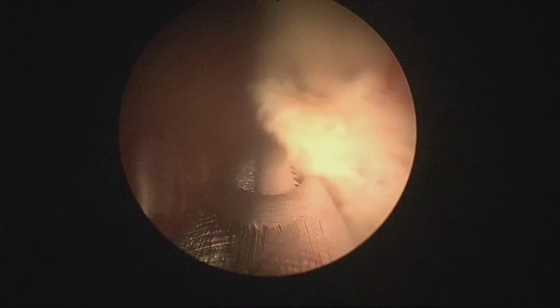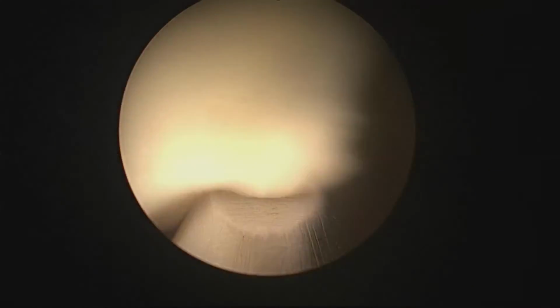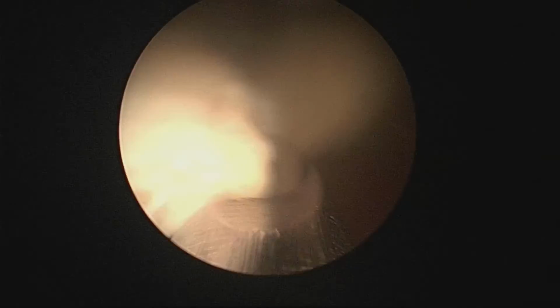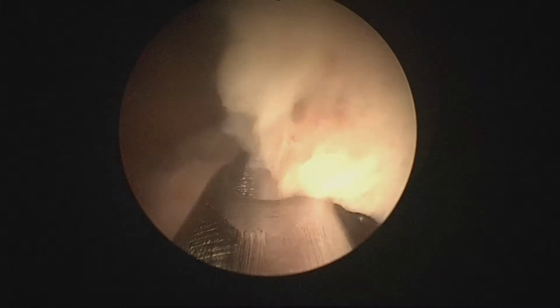So these operations are not lengthy anymore, mainly because of the morcellation. But I have to say that after using pulse modulation, we have noticed that we are faster because we don't spend too much time in hemostatic maneuvers during enucleation. So we can just go, dissect, and enucleate, and then we don't have to spend a lot of time doing additional coagulation.